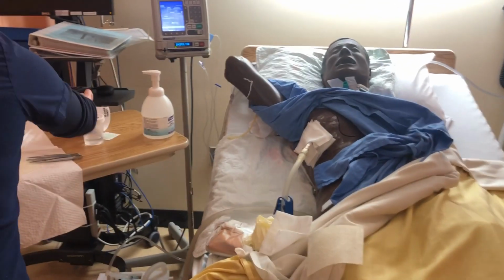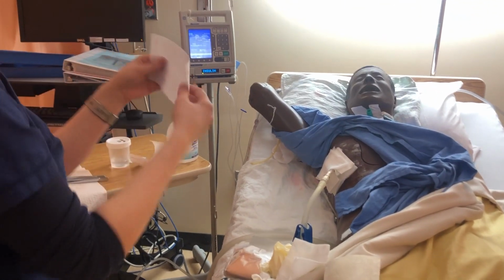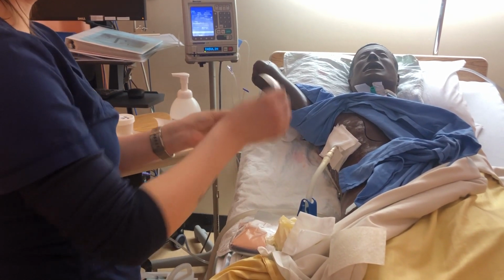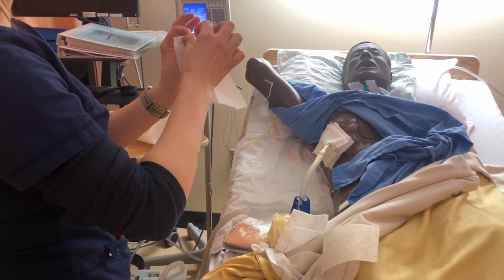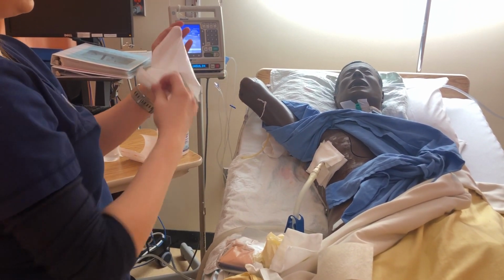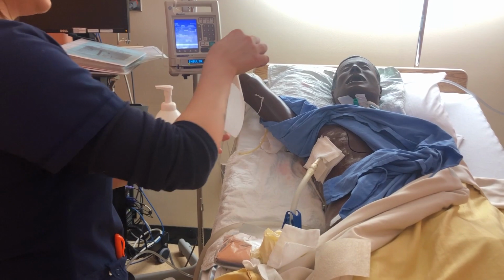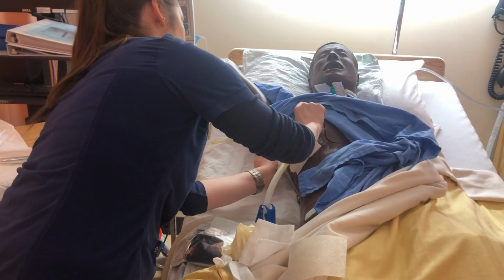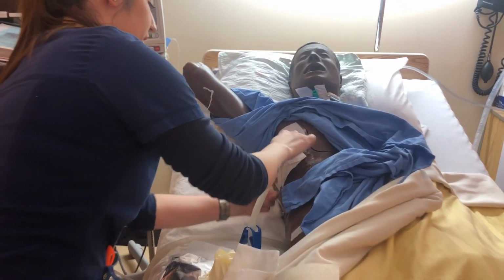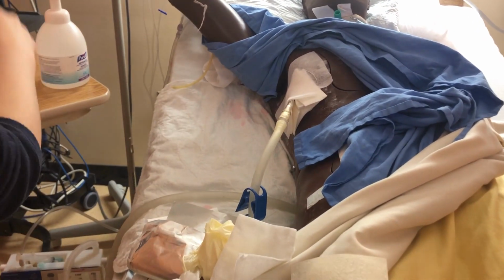So now I can place my cloth tape over top. And I'm wanting to make sure that the cloth tape reaches all the way around my patient's dressing because I want it to be totally occlusive. So I'm just going to squish the air out and make sure that it's all the way around the gauze.